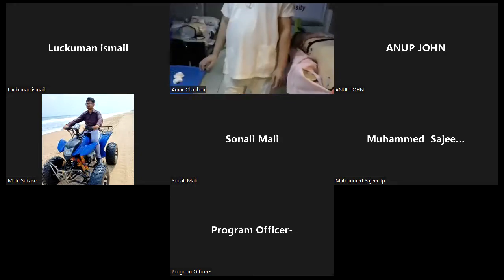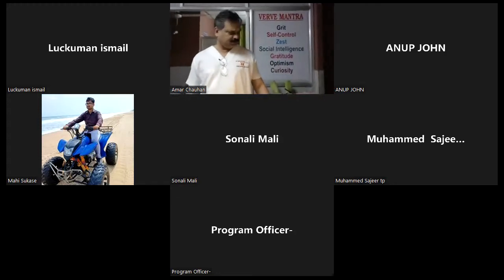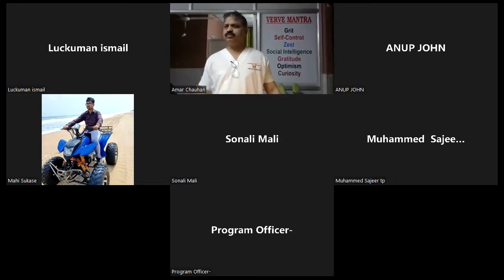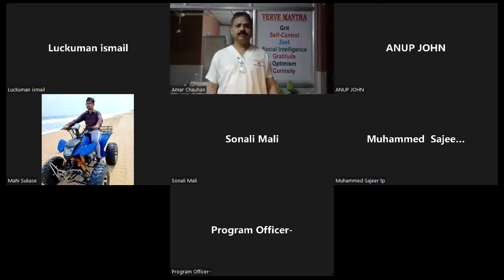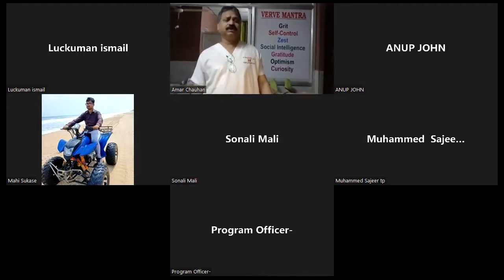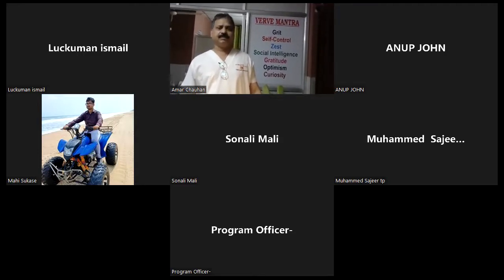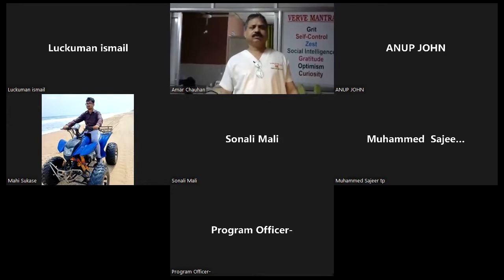Okay, Lukman, that was all. Sir, can we show the airway trainer, sir? Are we ready with airway or can we do it separately? Which one, infant or the adult? Adult airway. Actually, Lukman, we had a workshop yesterday. We right now don't have an adult airway trainer. Right, sir. We'll study it separately. We have only infant. Okay, Sajir, just note it down. We haven't done the adult airway trainer.